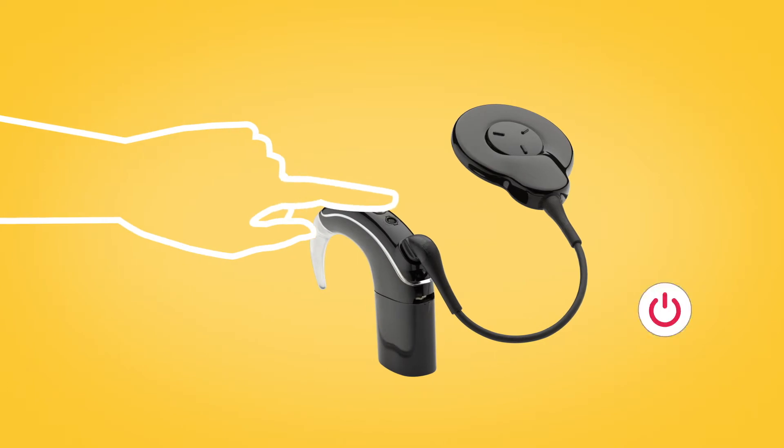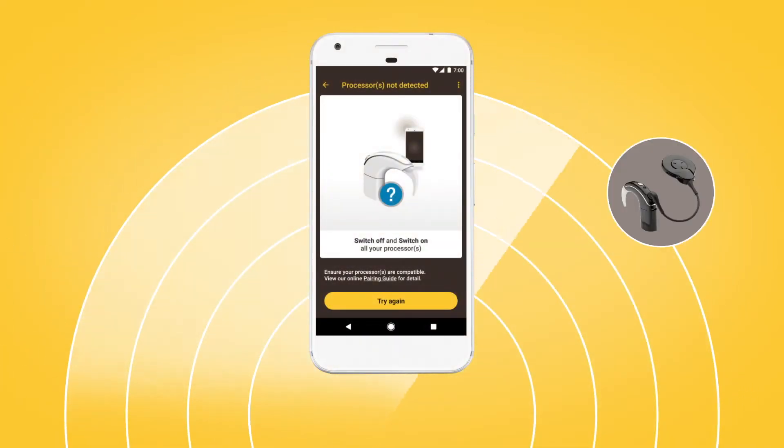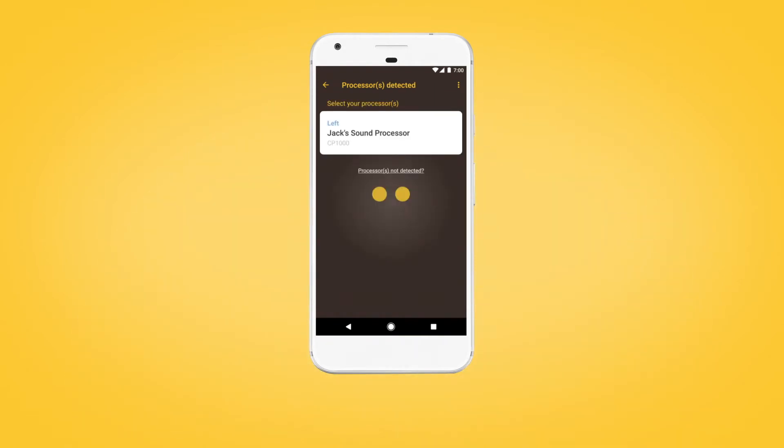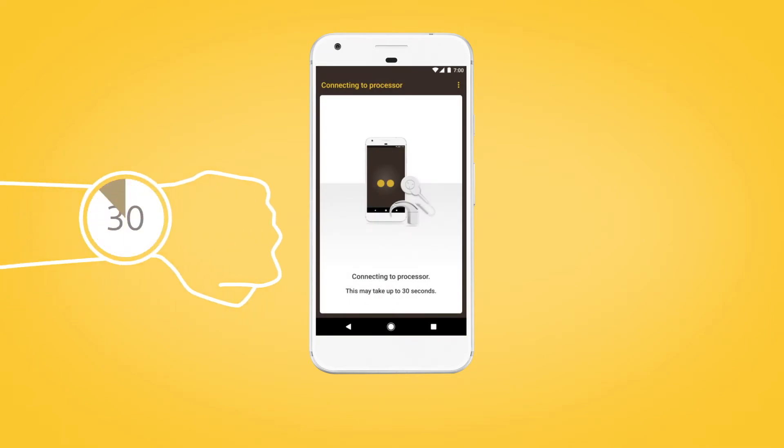Next, turn your sound processor off and back on again. Your Android device will then search for your processor and display it on your screen. When your sound processor displays, tap once to begin pairing. The pairing process may take up to 30 seconds.